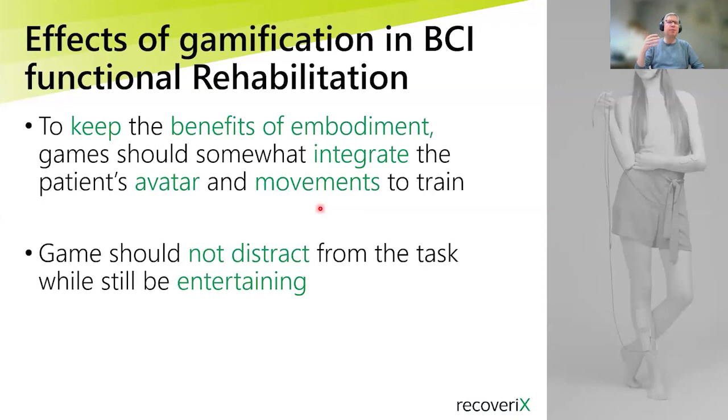So you should still be focused on the motor imagery, not purely on the game, because in the end you want the perfect rehabilitation, and it should still be entertaining. So a lot of things to consider.